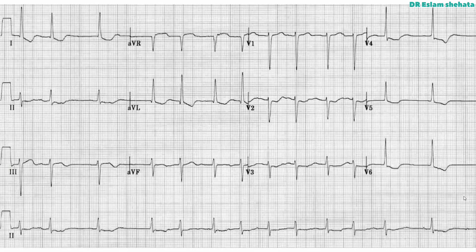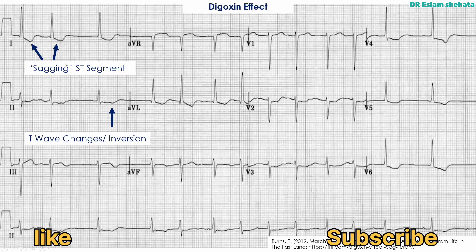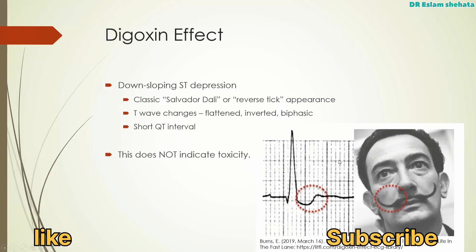Here's another example. This is an example of the digoxin effect. The key changes are these sagging ST segments and T wave inversion. The classic signs of the digoxin effect are this down-sloping ST segment depression, and it's called the Salvador Dali or reverse tick appearance.